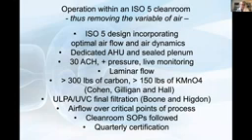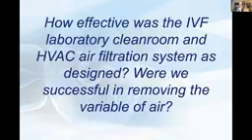But the gem of this lab, although we didn't realize it for about 8 to 10 years, was the live monitoring that was done. The live monitoring really was only being conducted so that we could be certified as an operational clean room. But it's the data from the live monitoring of VOCs, viables and non-viables, that really taught us what airborne metrics were truly critical to the culture environment, to culture the human embryo.